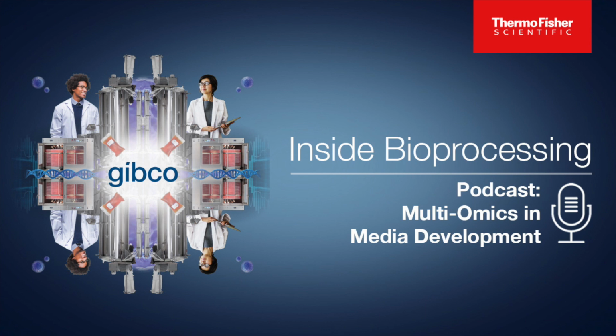So what is regulating those pathways and turning certain pathways on or off? That all is going to be coming from the proteomics portion of it. The metabolomics gives us then that context of where the metabolites are actually going. So a pathway could be there, it could be available for the cells to use, but if the metabolites are not flowing through that pathway, then something is stopping that pathway from being used.